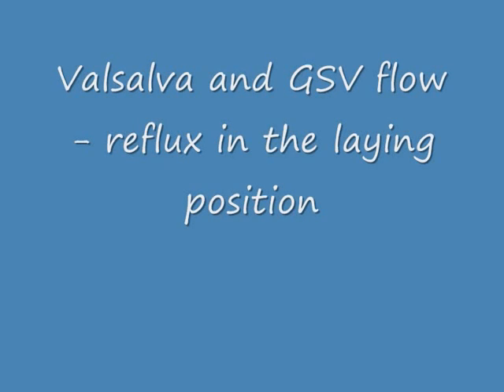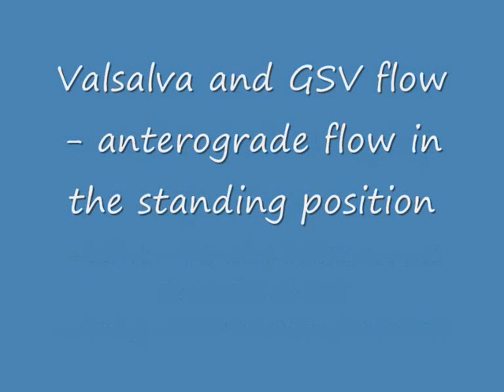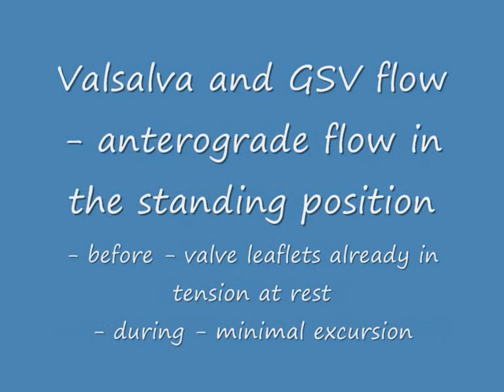The GSV reflux with Valsalva was present only in the laying position, while it disappeared in the standing position, when before the Valsalva the valve leaflets were already in tension at rest, bearing the weight of the hydrostatic column, so that during the Valsalva the excursion was less wide.